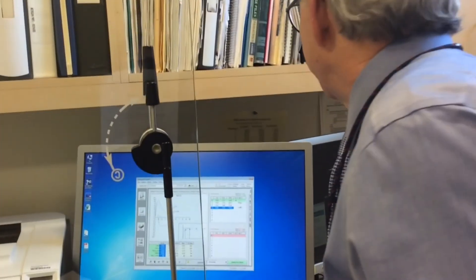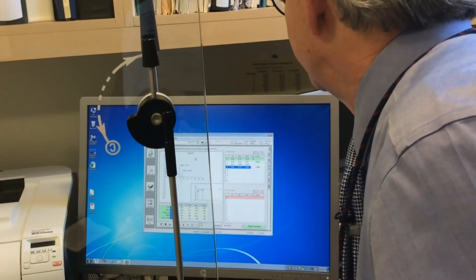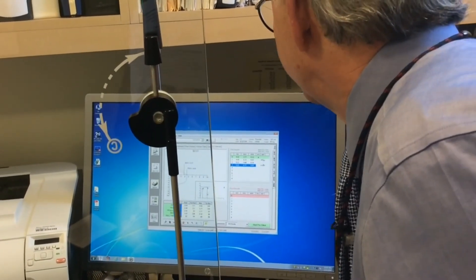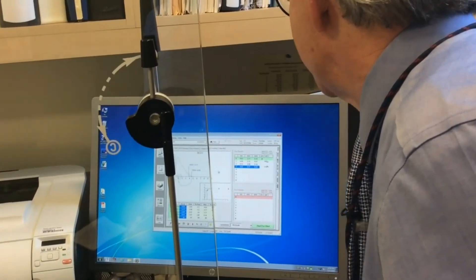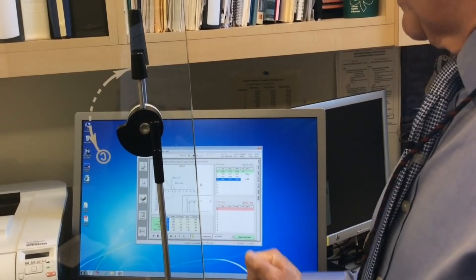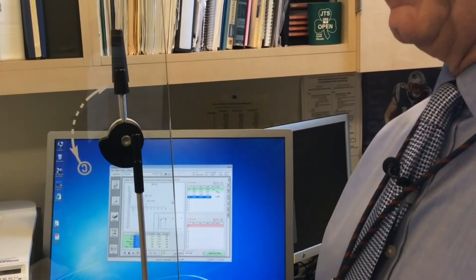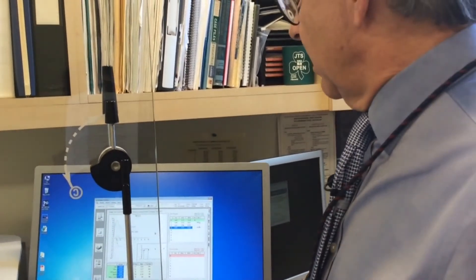It keeps getting better with each one. She almost made six seconds on that one. Sometimes people with normal lungs will empty out a little bit quicker. So we may continue to do a few more here. That covers the forced vital capacity test.